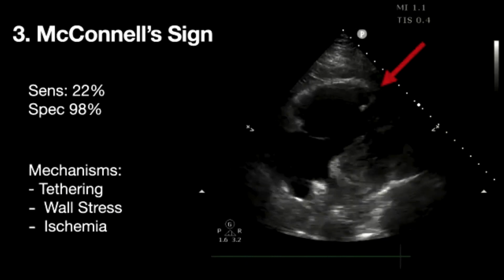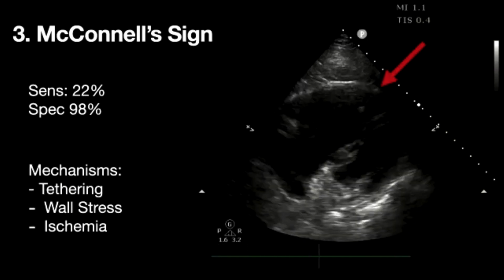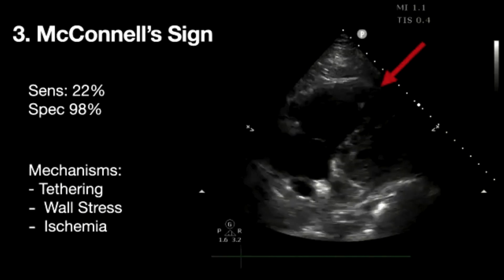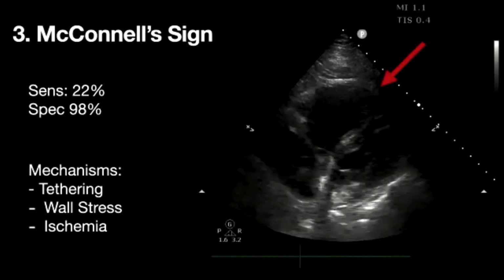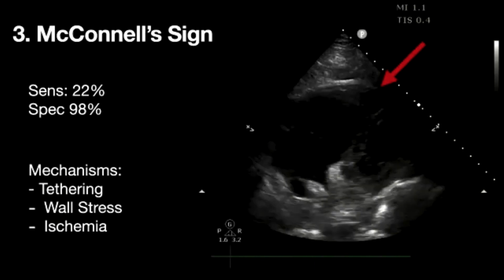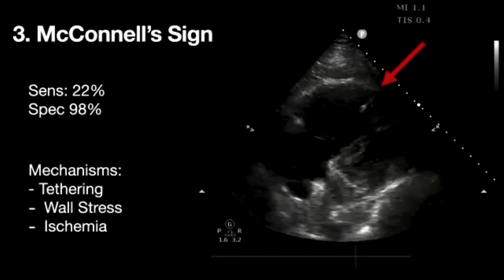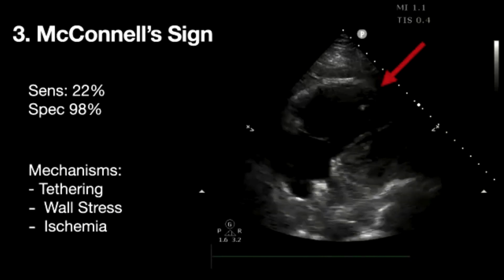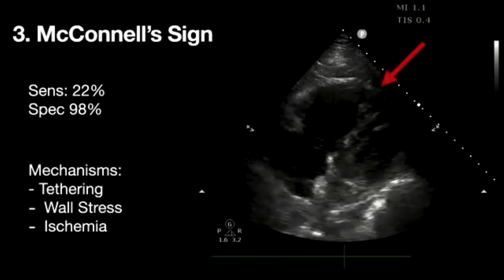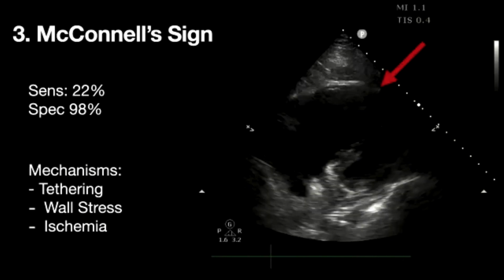And what the societies tell us to do is to actually perform what's called a right ventricular focused view. The right ventricular focused view requires that the transducer be moved a little bit medially and be rocked a little bit. In theory, I think it has to be done. It would be much nicer if you're at a patient's bedside to actually demonstrate the focused right ventricular view, which brings out the correct size of the right ventricle. And that's the view in which we recommend measuring the maximal extent of the right ventricular base. So those are some of the additional issues, but I think you covered it really, really well.